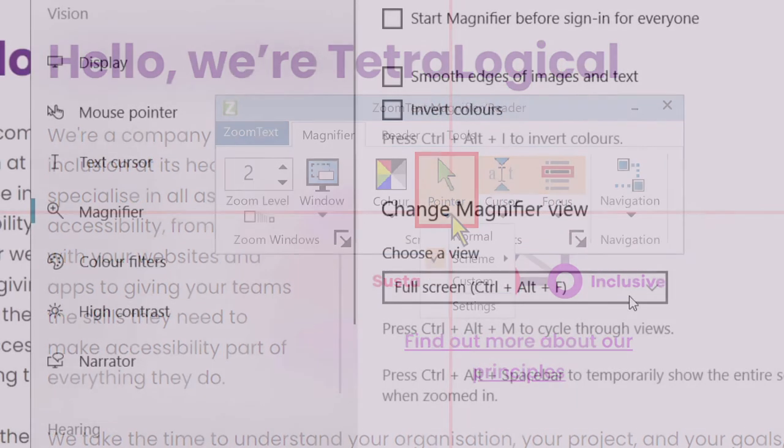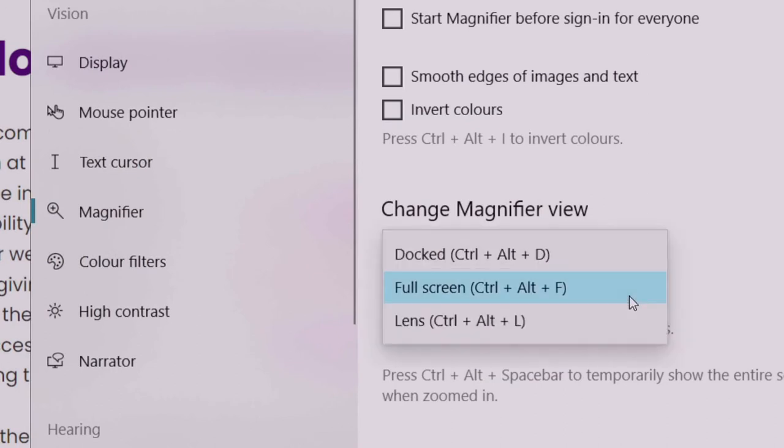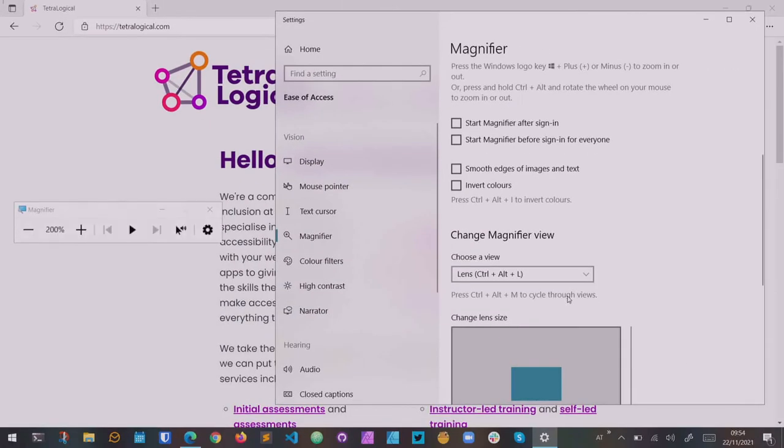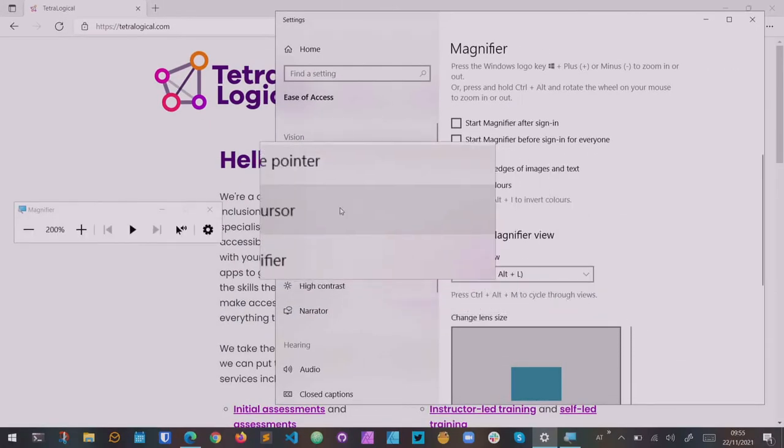You can use different magnification modes for different tasks. You can magnify the whole screen or use a magnifying lens that can be moved around the otherwise unmagnified screen.